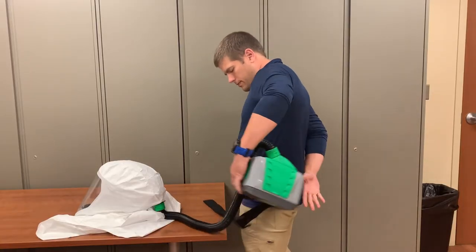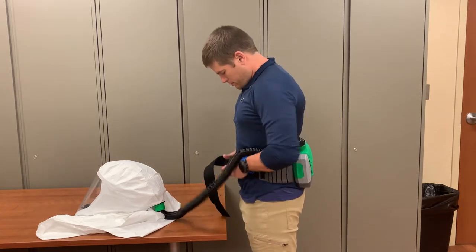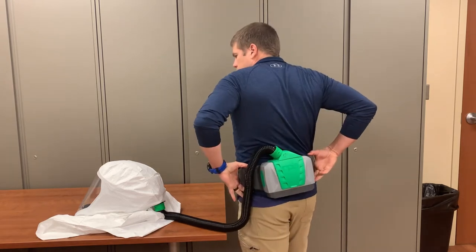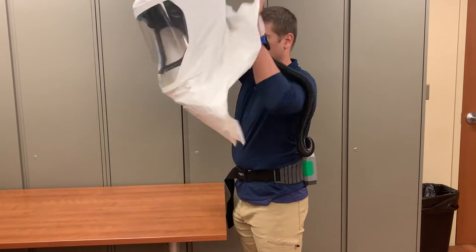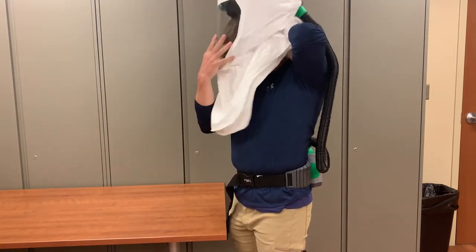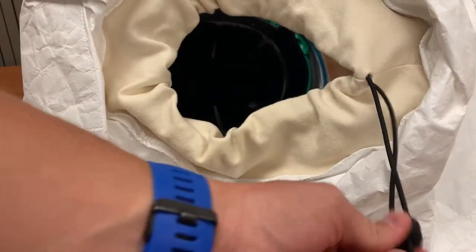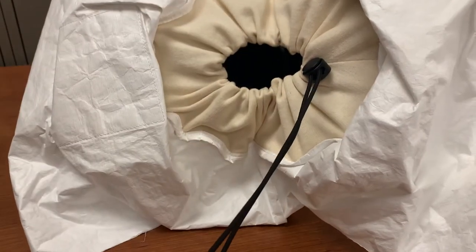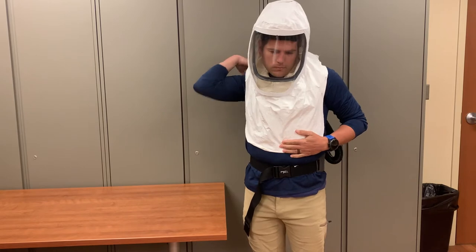To don the PAPR, clip the unit around your waist using the attached belt. The unit should sit comfortably on your lower back. Pull the hood over your head. Inside the hood, there is a cord that can be cinched tight to form around your neck for further protection and stability. Straighten out the apron and you have successfully donned your PAPR.